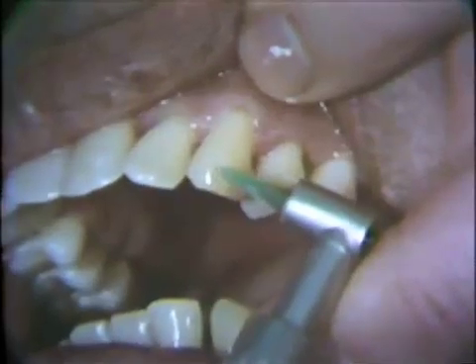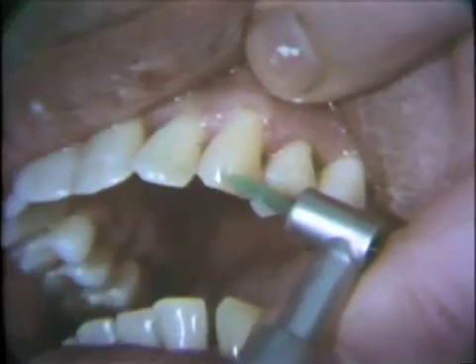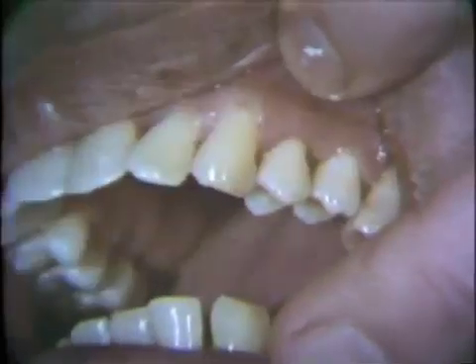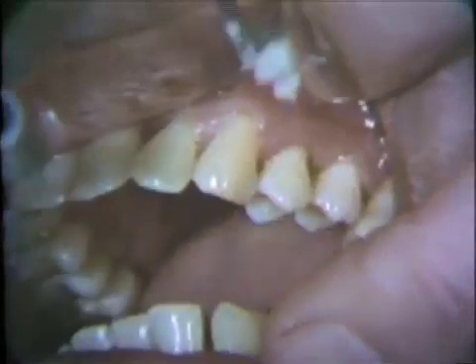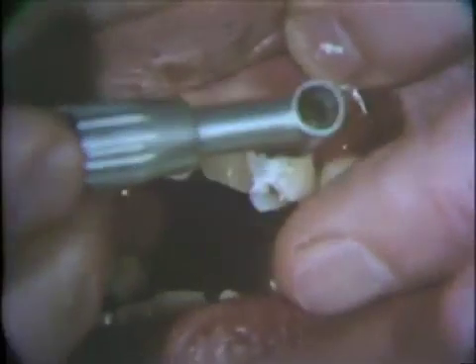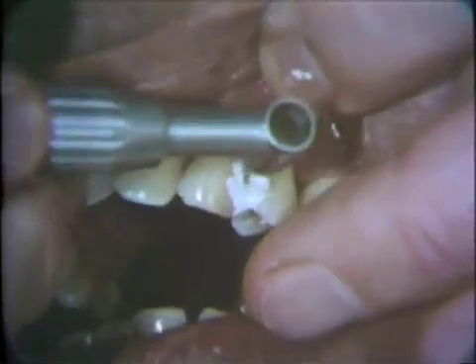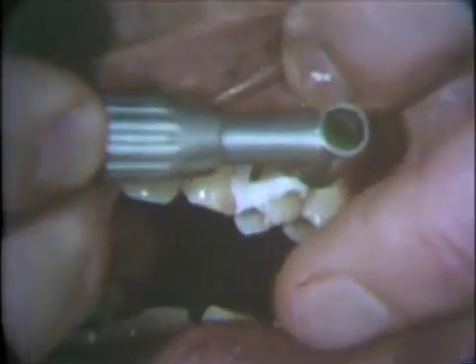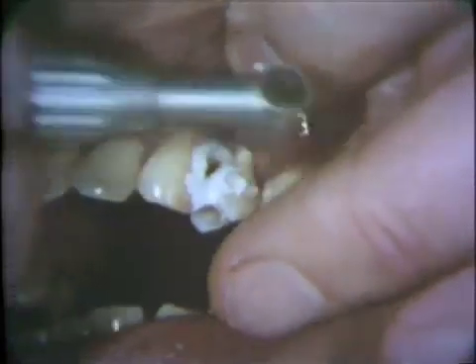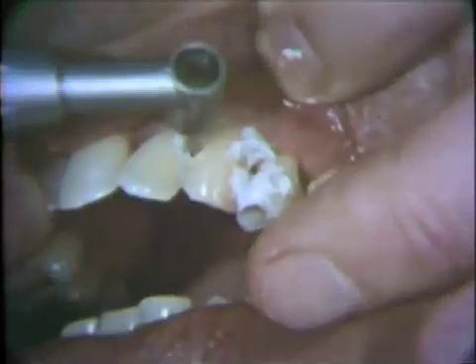The back and forth action of the polishing tip is shown here as it is held against the maxillary cuspid. There is also available a very thin diamond coated tip that can be used with this contra-angle for the removal of overhanging margins of amalgam or gold restorations. Polishing must follow the use of the diamond abrasive.